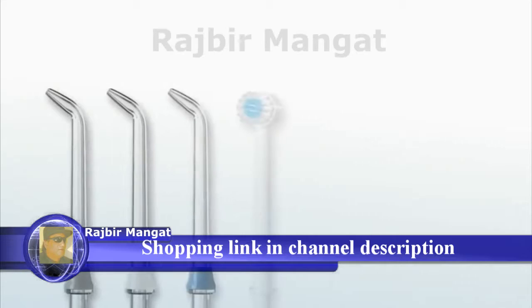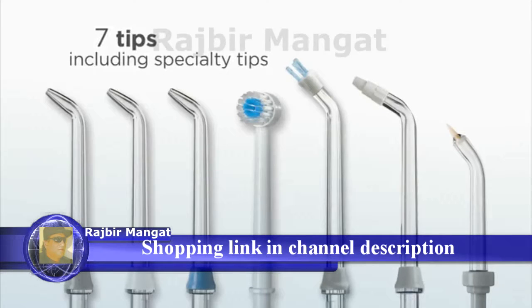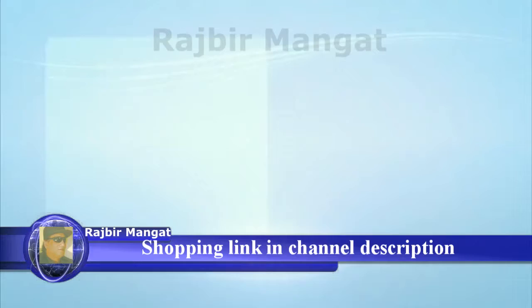Seven tips, including all of the specialty tips for braces, implants, and other dental work.